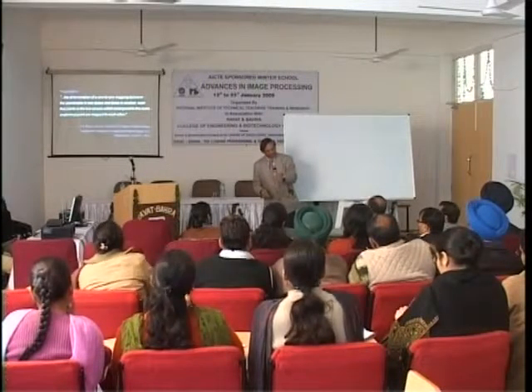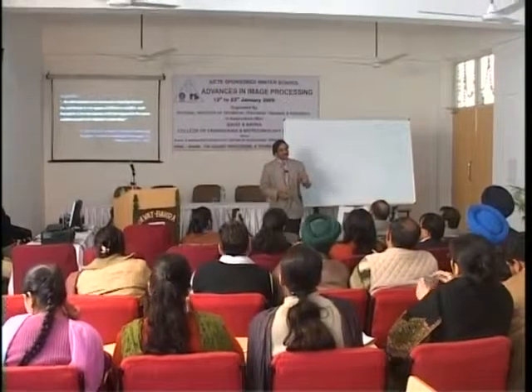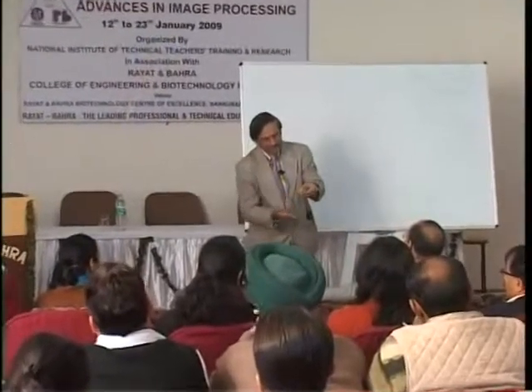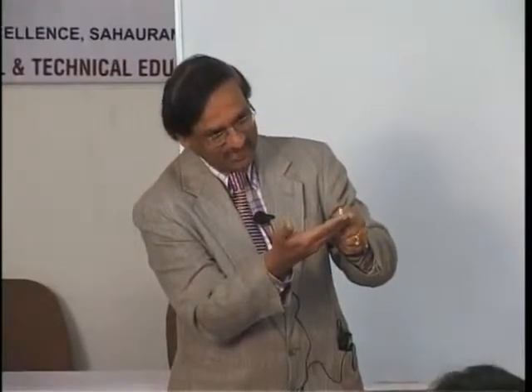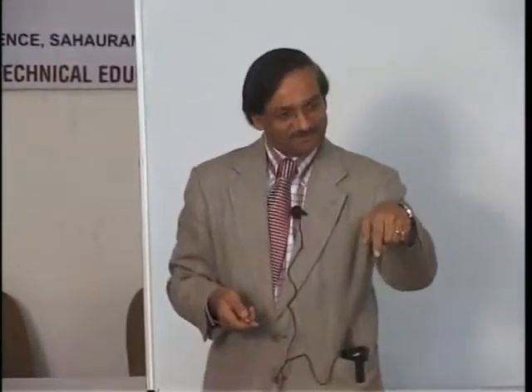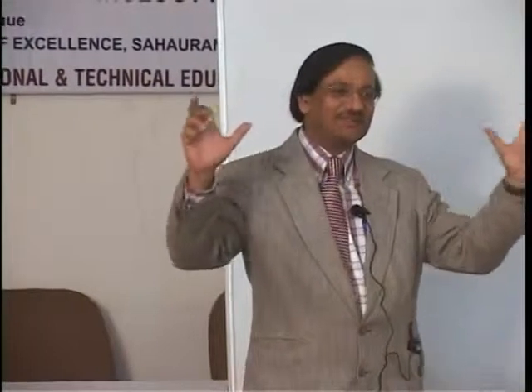What should registration do? It should be able to correct, if your software is so strong, even if you are putting a patient in a scanner at a different height. You are putting the same patient at a different height, so even your couch positions will be rectified. That's what correct registration is. So in the image, finally, the most important thing is the registration. If the registration is correct, your fusion is just done.